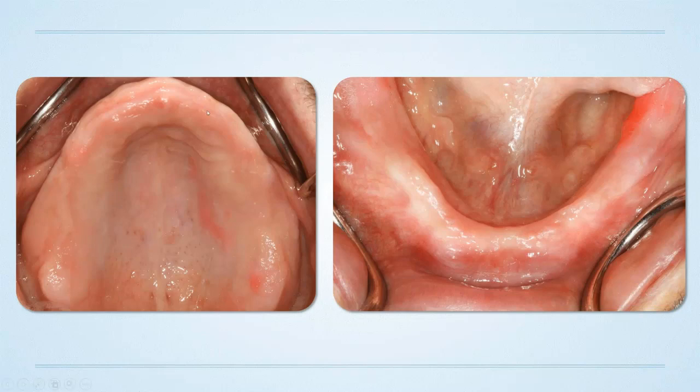You can see here that, yes, like I mentioned before, we're training dental school to look at the arch conformation. Is this a good patient for a plain denture? Is this a good patient for an implant overdenture? Could I put a couple of implants in here? Easily. But really, this patient came to me for a limited exam. But we have to think beyond just the limited exams, because take a look in here.